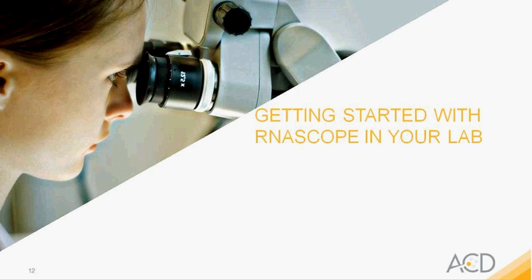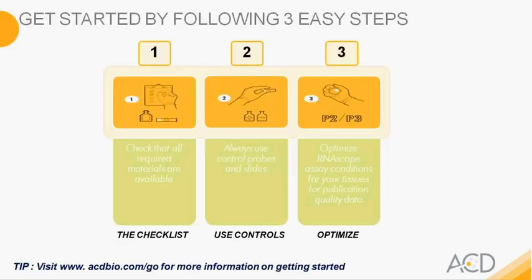So now that we've reviewed RNAscope technology and the workflow, we'd like to discuss how to get started with RNAscope in your lab. We have consolidated getting started into 3 easy steps. The first step that we recommend is to look at your checklist. Checklists are available in all manuals for you to review the required reagents and materials before you run the assay. We also recommend you use controls, and we will be discussing some of these features later. The third step is to optimize your assay.